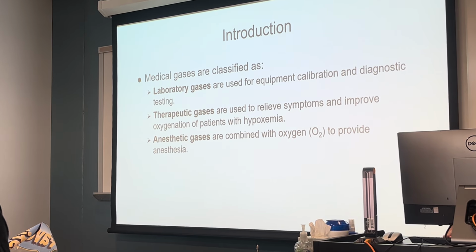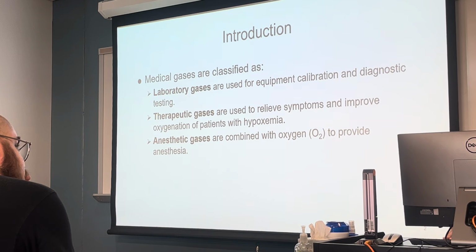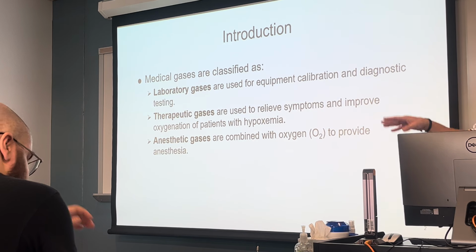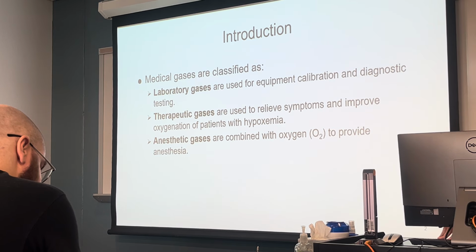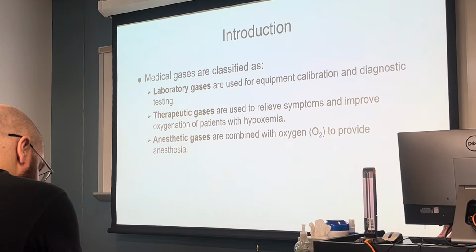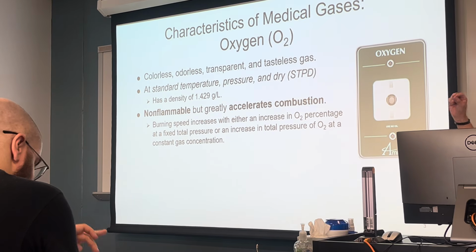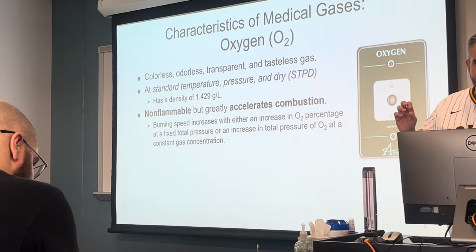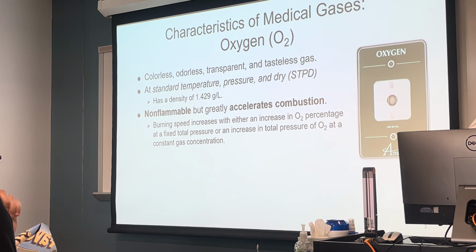It can be used in the pulmonary function lab. Sometimes we use gases in our ABG lab. We'll get into the specifics a little bit later on how we do that. Gases can also be used for anesthetic purposes and anesthesia. So, let's go ahead and hit every single medical gas we could potentially encounter in respiratory care.